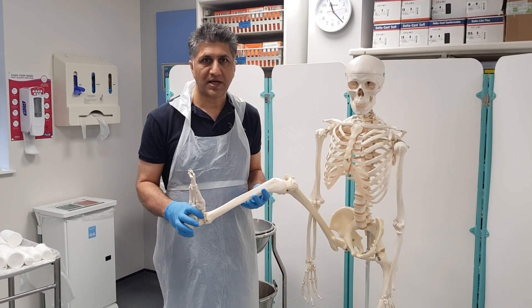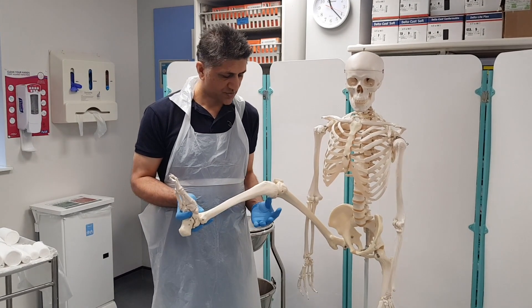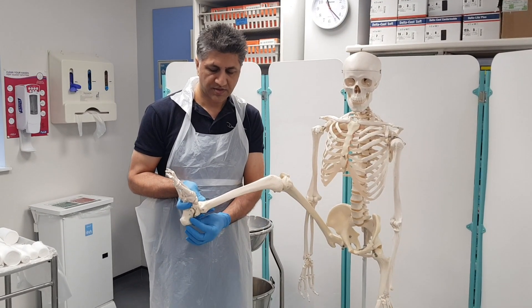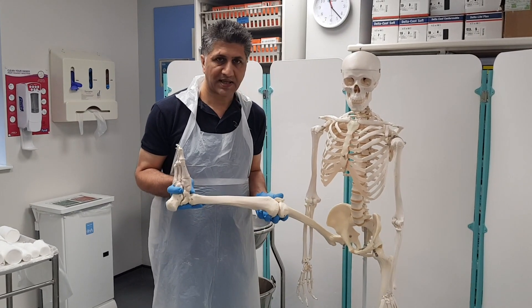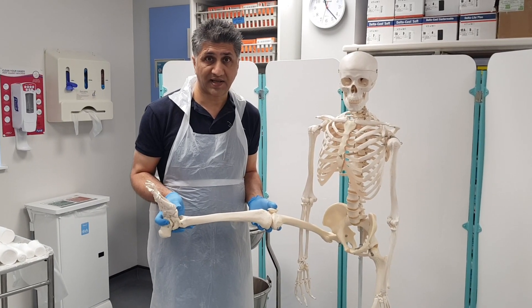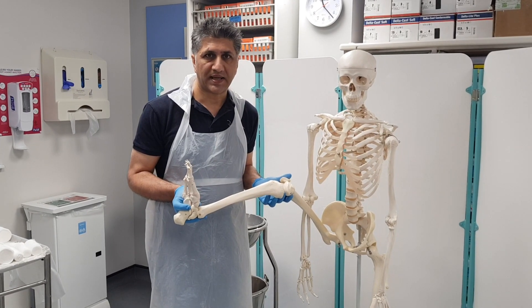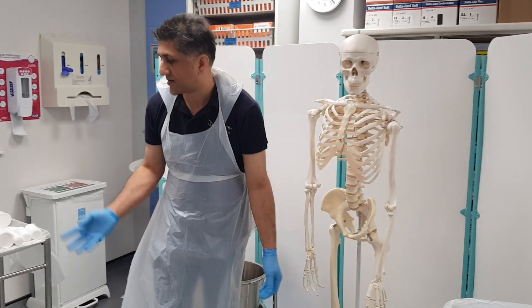It's important that we have the foot at 90 degrees so that we don't develop an equinus contracture within the plaster. The gastrocnemius muscle arises from the back of the femoral condyles and goes down to the heel. If the knee is out straight, gastrocnemius will be tight and the foot will necessarily be in plantar flexion. So we want to get the knee bent so that it allows us to dorsiflex the ankle and get it into a neutral position.